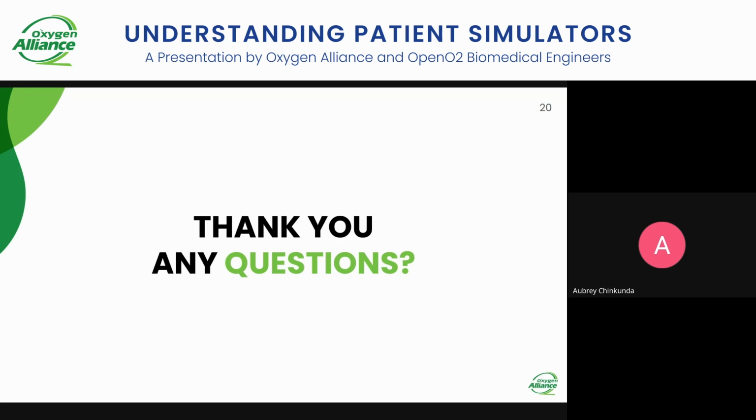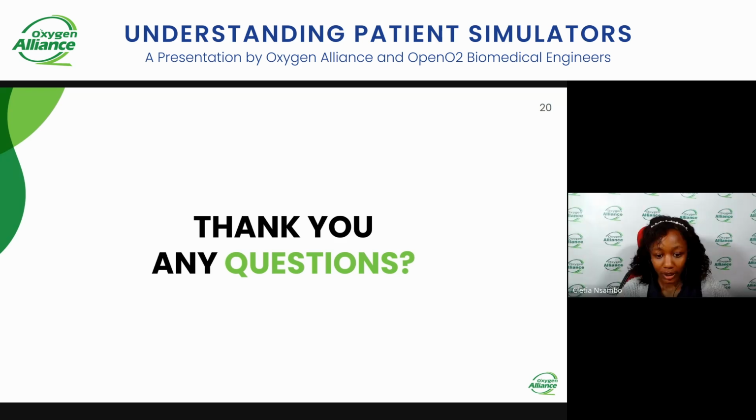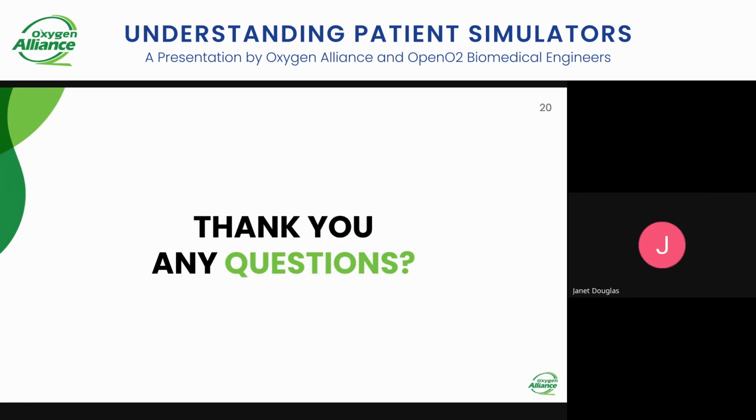I'll take the last question for today. The question is from Mason. What would be the consequences of powering on the simulator before connecting the electrodes? All right. Like I said earlier, you're supposed to connect first before you power on.